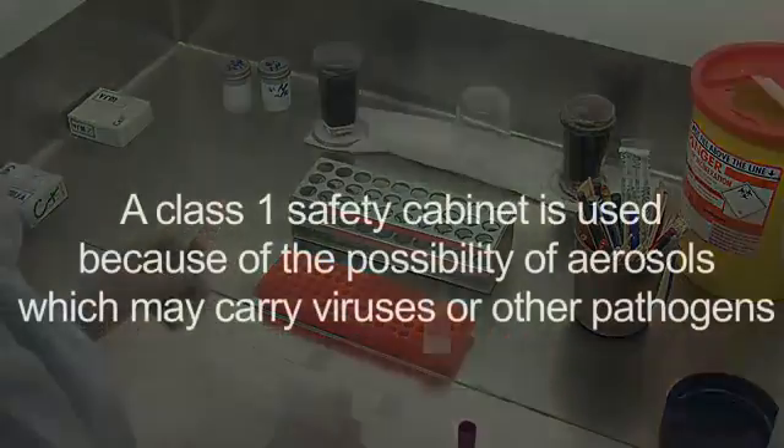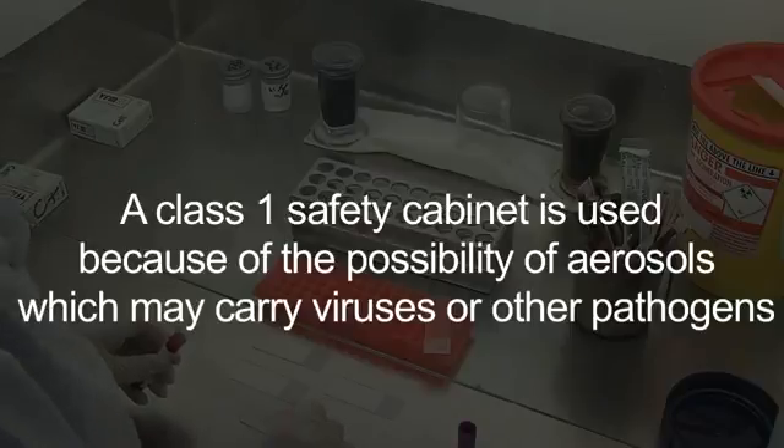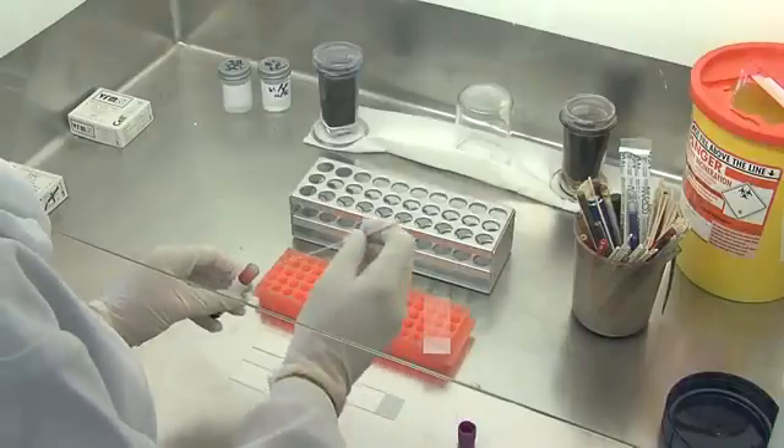We're performing this in the Class 1 cabinet, because of course there may be viruses or other parasites, so everything is performed in the Class 1 cabinet.